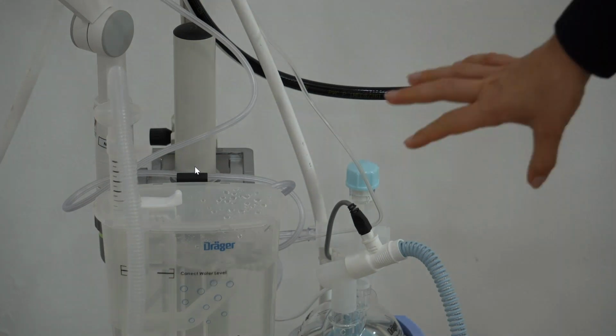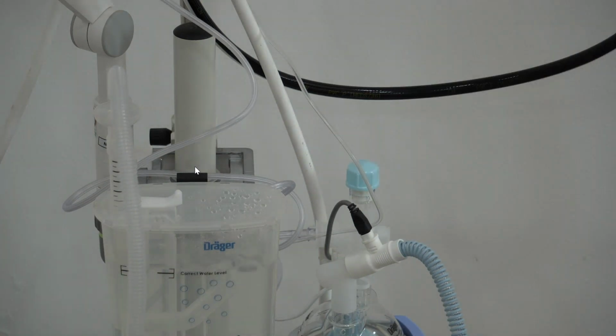In this system, we have no possibility to really measure or control the minute volume because the patient is breathing spontaneously. Of course, you can deliver NO therapy, but you would not have the information on how much minute volume is in the system, so you might not have control over the use of your NO therapy. So I don't think that in this setup you would opt for an NO therapy solution.